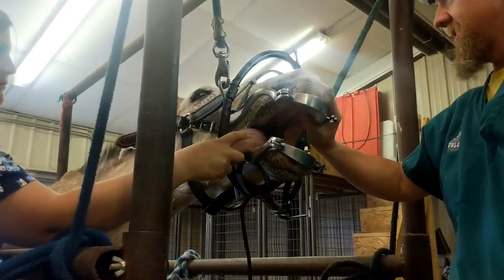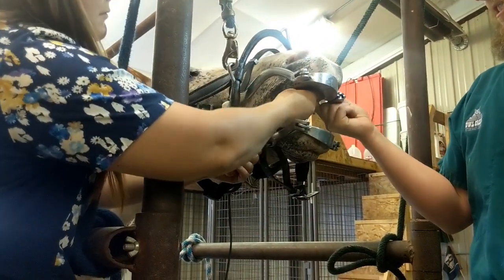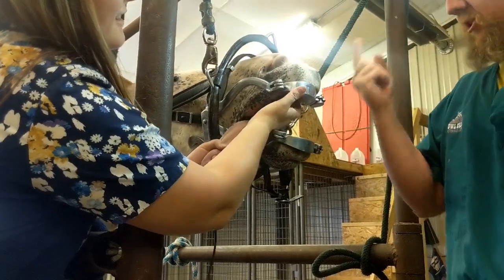That one under there — you're feeling it, right? It never emerged, but you can feel that tooth right under the gums. Push hard enough and you hit two.